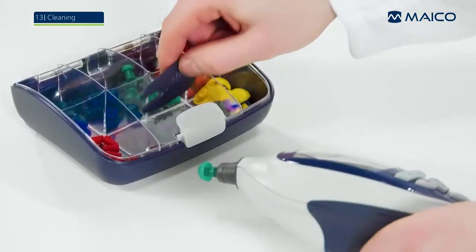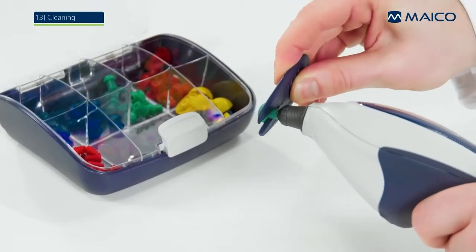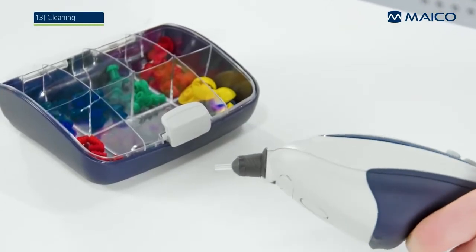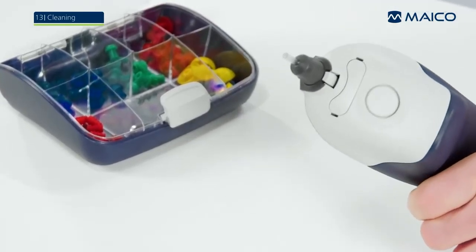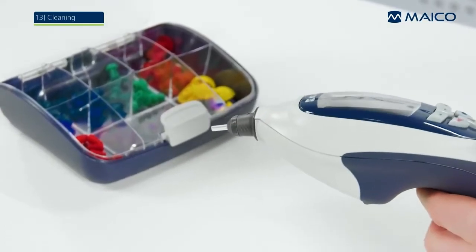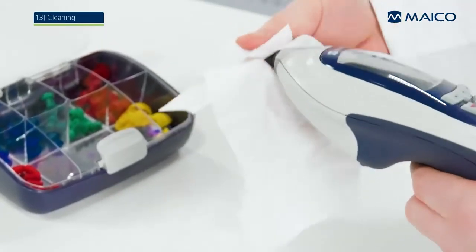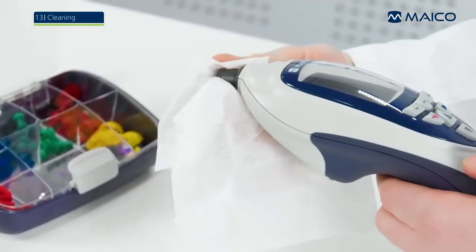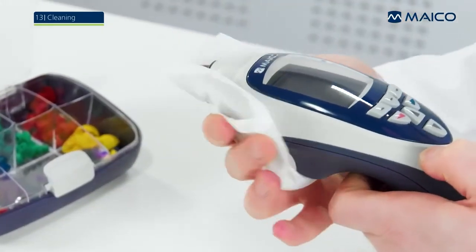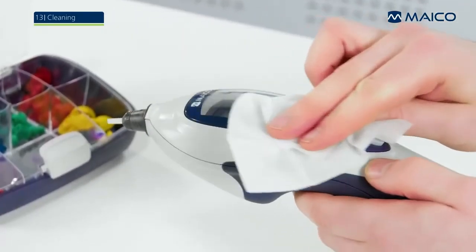To clean the probe of the easyTymp, remove the single-use ear tip and dispose of it. Inspect the probe tip for debris. Wipe all probe parts with disinfectant wipe. Disinfect the housing of the easyTymp and its accessories by wiping the surfaces with a disinfectant wipe.